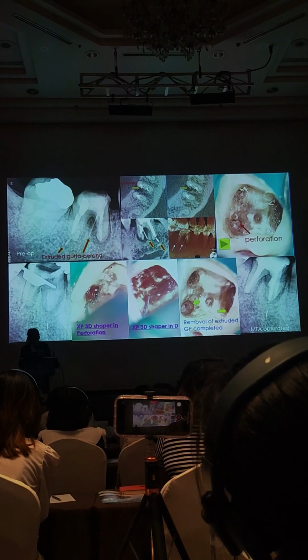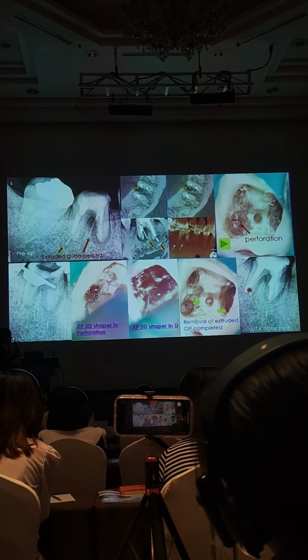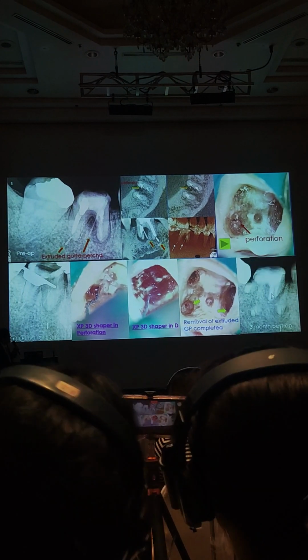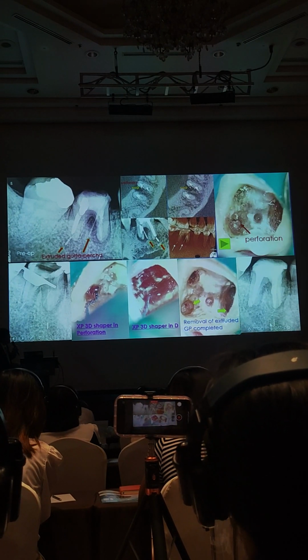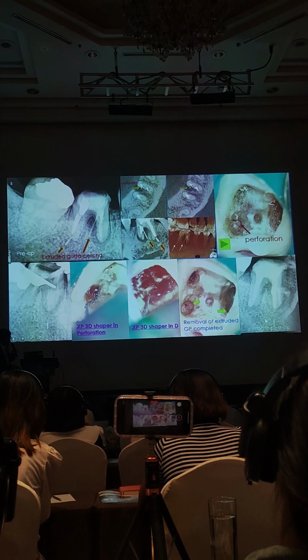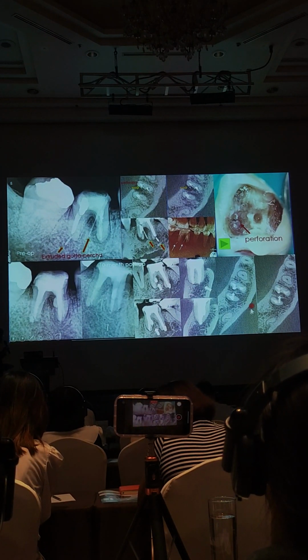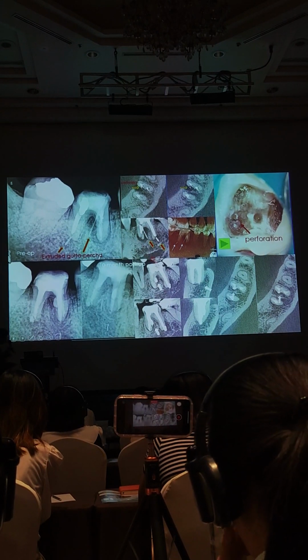And this is a post-op. I obturated the canals with MTA, a little bit of extrusion, it's okay. And you see the perforation repair with MTA here. And this is a 3 months post-op. And this is 6 months post-op showing nice periapical healing. So I took CBCT. CBCT also shows nice periapical healing compared to the pre-op radiograph and CBCT images.